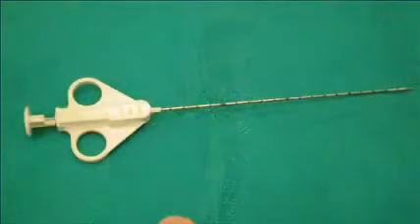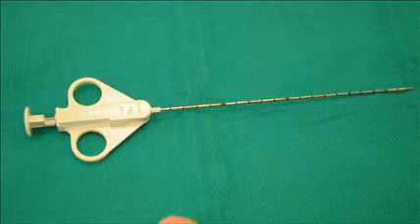The drive of our study was to find an easier way to do it as an outpatient procedure, and that's what we've developed with this percutaneous method, which in short form is PEAT, P-E-A-T, full-thickness gastric biopsy. I'm going to demonstrate this biopsy, and then I'm going to show a brief video clip of the procedure done in an actual human. I'll now demonstrate the actual needle procedure.